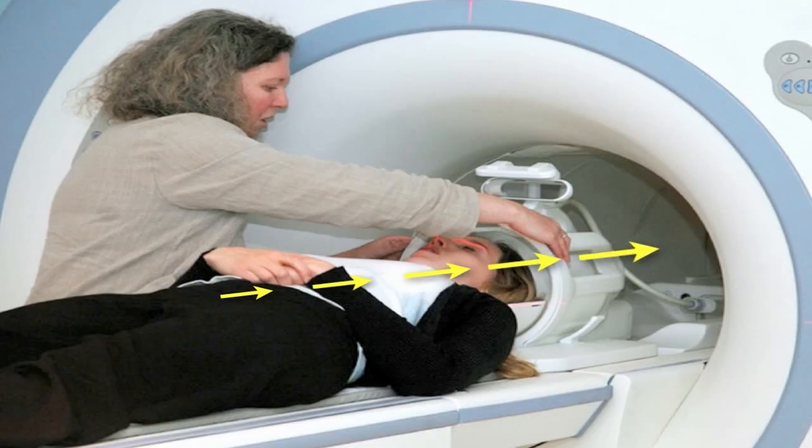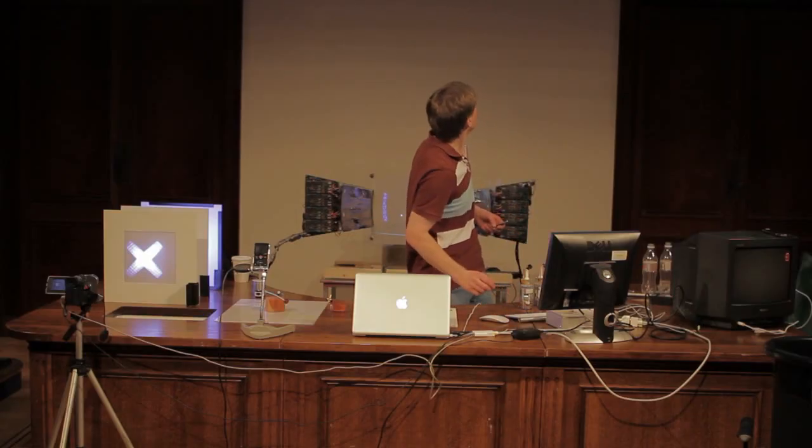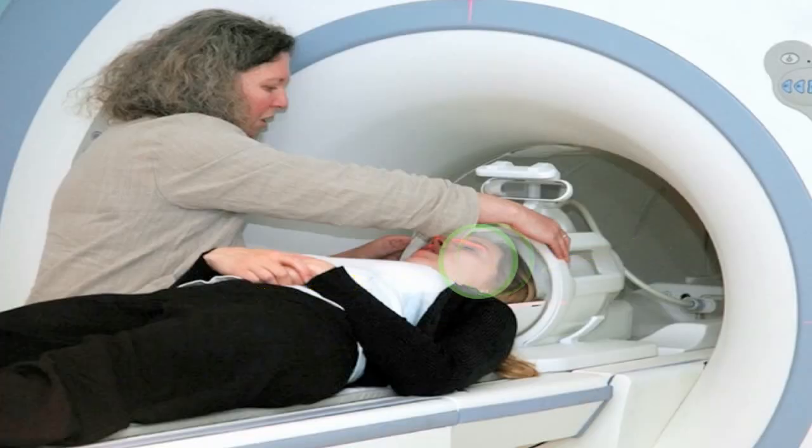So we put our patient in the scanner and we'll make different parts of the body sing at different notes by making the magnetic field stronger at the head than it is at the feet. So now we've got different parts of the body singing different notes. So we can get a signal from different slices within the body.